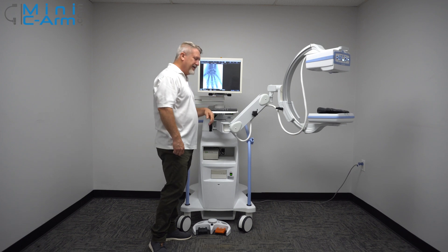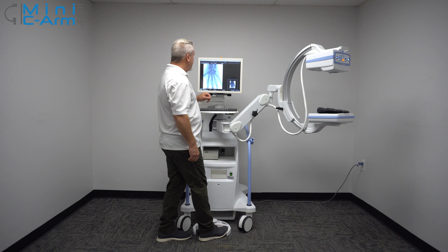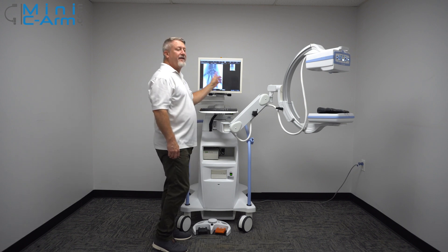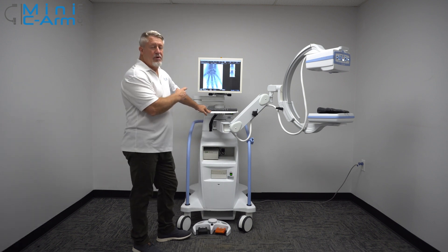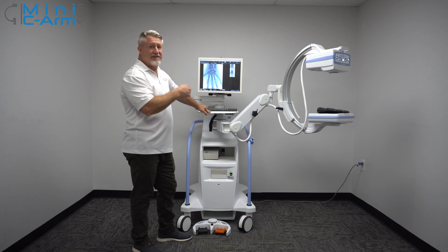Also, in between pressing the button, wait about a second — and I'll show you why here. When this populates, then you can go ahead and initiate another fluoro or another single shot. This just makes sure that the system runs properly and it works as expected.